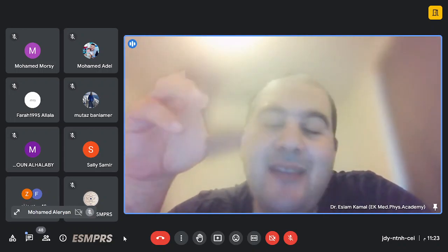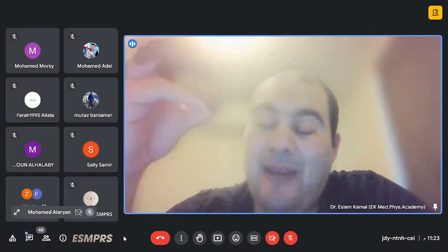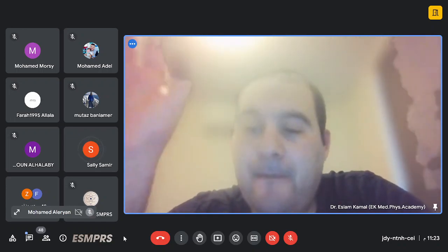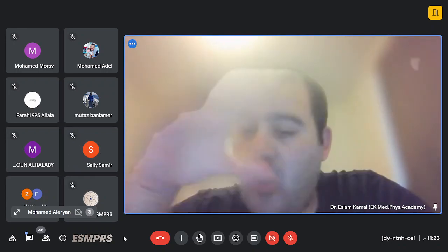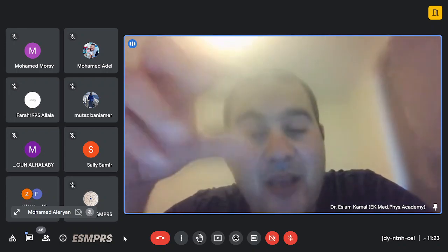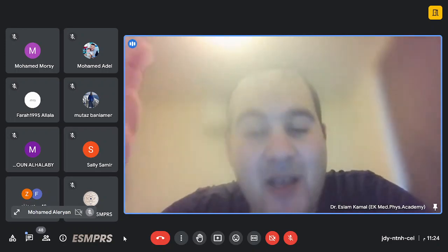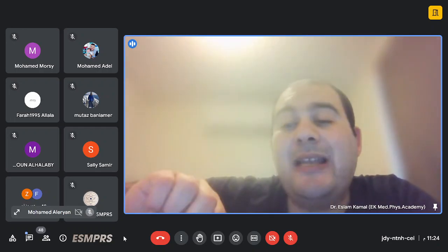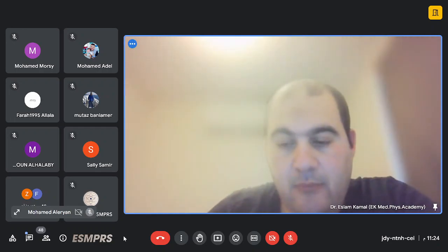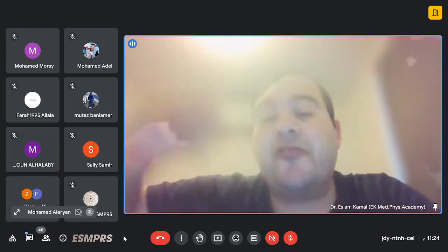عشان كده لو عندك تيومر وبتحقن العيان صبغة بناخد T1 سيكونس ما بناخدش T2. طب ليه؟ لأن الـ T1 سيكونس بالنسبة لك هو الستاندر في الصبغات. هديك مثال على الصبغة لأن دايماً بيستخدموا النانو بارتكلز، الجادولينيوم. الجادولينيوم مرتبط بالـ DTPA، ويبقى عندك بايندنج سايت حر بيلعب في البريسيشن فريكوانسي بتاع البروتونات، فبيخليها يحصل لها ديفيزنج أسرع. فالديفيزنج ده بيخلي الريكفري بتاع T1 للصبغة للمكان اللي فيه صبغة سريع.